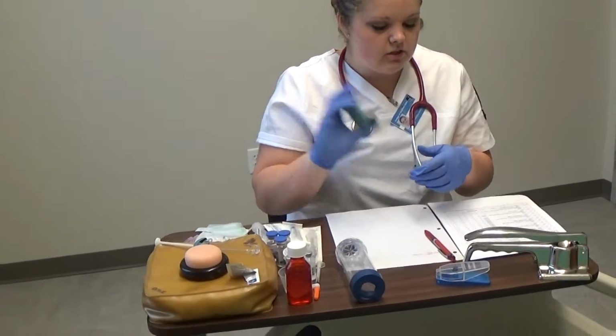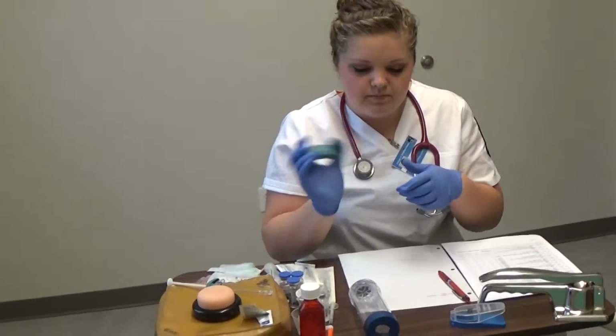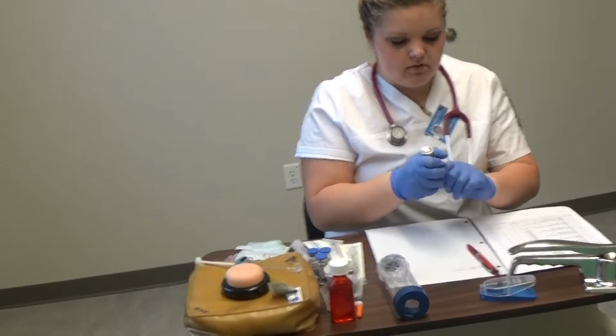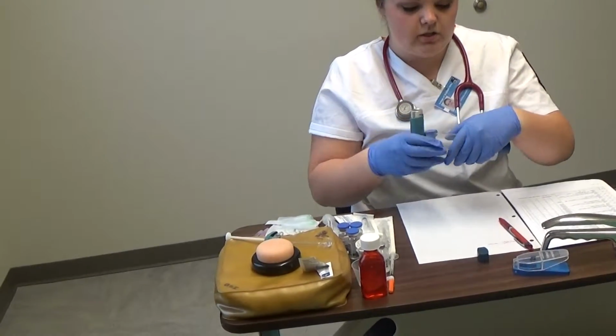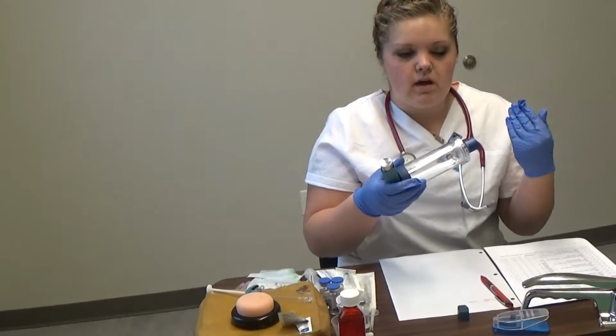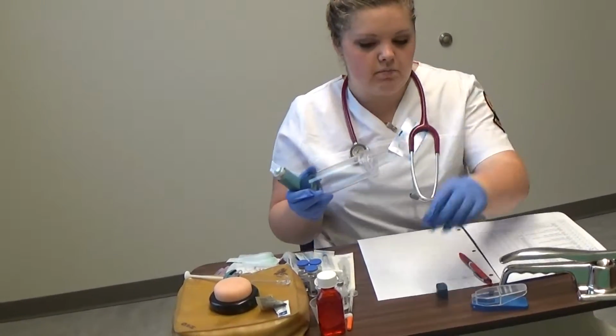Alright, go ahead and do that. Shake it 5 to 6 times just to make sure it's good and mixed up. Alright, so we're going to just open it, and then I'm going to attach it here. So what we're going to do here is have the patient do a nice big exhale before they take it. Take the cap off, of course.